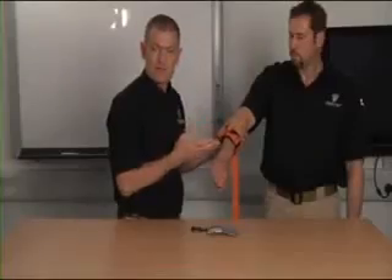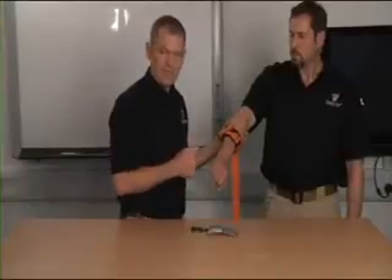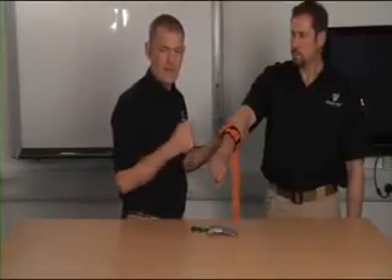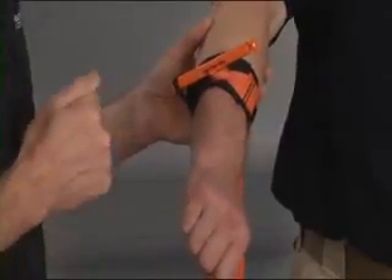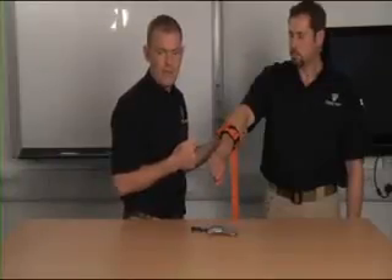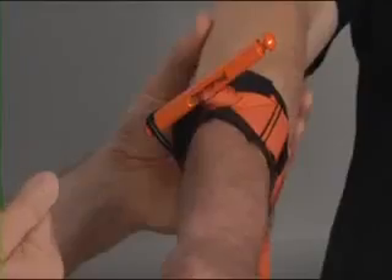I'm now reassessing the patient, confirming that they're not bleeding, and importantly I'm going to document that I have applied a tourniquet to this limb and I'll record the time of application. Documenting the application time of tourniquets can be done on a patient report form, and in a major incident with multiple casualties it can be done simply by writing on the patient.